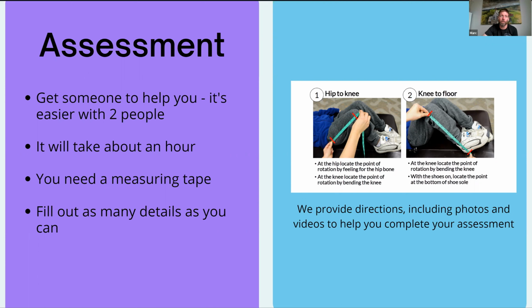Typically, what I'm trying to do is to put your kiddo into the biggest size device that we can. As you're aware, there are multiple sizes of Trexos, and when kiddos grow from one size to the next, there has to be a size growth in the device as well. What I'm typically trying to do is to get your kiddo to fit into the biggest size possible so that they have the largest room to grow into the device. Depending on your child's size, you'll fall into one of 4 or 5 categories.